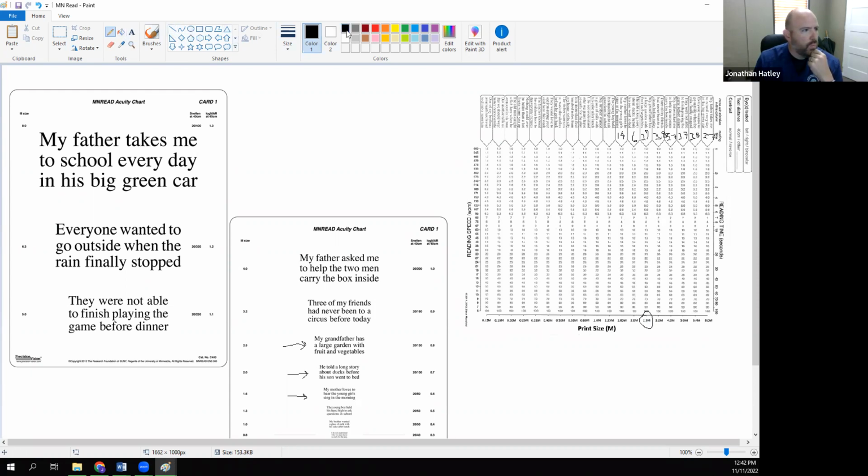Now, if the clinician wants, something that's totally fine for them to do is to come down here. If they need to visualize it, they can use this and go, okay, 3.7 seconds is here, 3.8 is here, 3.7, 3.7, 3.8, 3.9, and then 6 and 14.